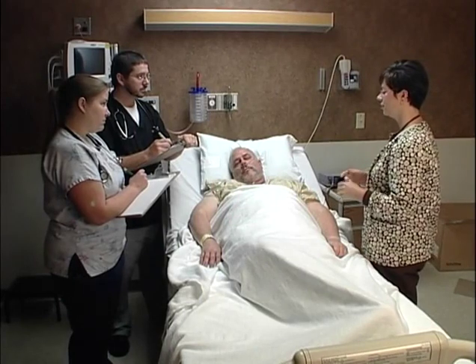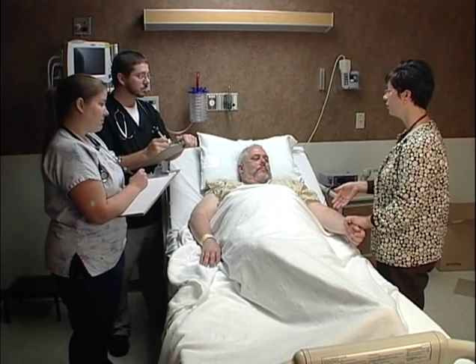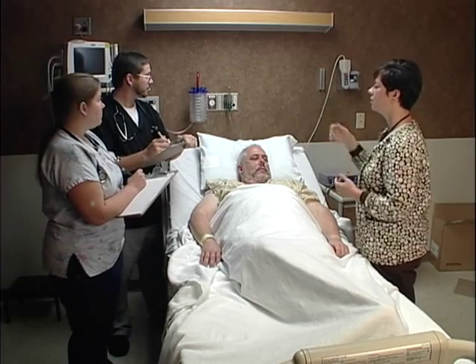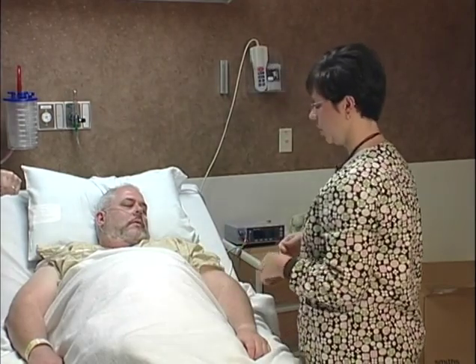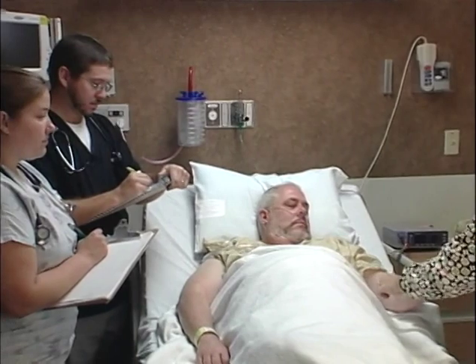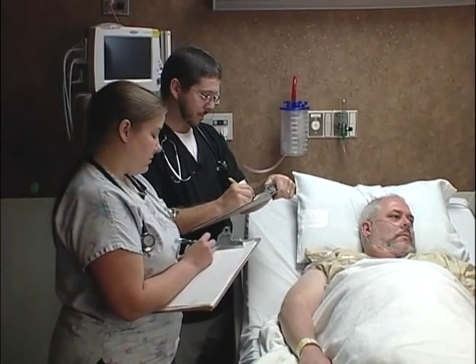results. Performing arterial and capillary punctures requires comprehensive training, which should include detailed instruction on respiratory physiology, anatomy, site selection and preparation, pre-analytical errors, and the risks associated with such collections. Collectors should follow standard precautions throughout the sampling and handling of blood gas specimens as prescribed by their institution's policy.